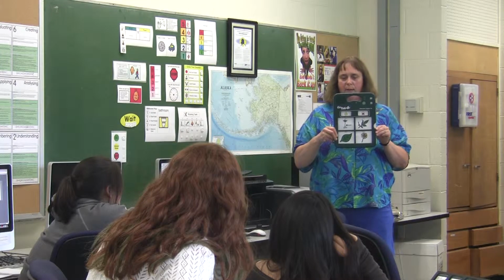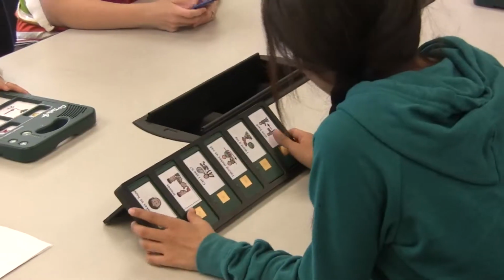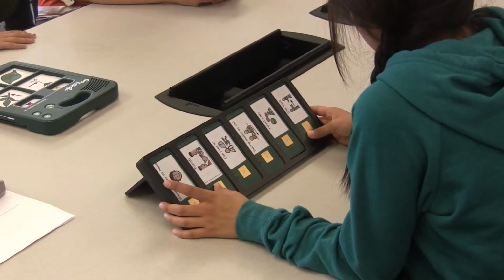So this is an example of a communication device for students that don't have a voice or don't have verbal capabilities and haven't learned how to sign or what have you yet. So this is the GoTalk 4, and then as I said, this would be for someone in a wheelchair. And this is kind of an example. I've kept this because this is an example of how not to do it.